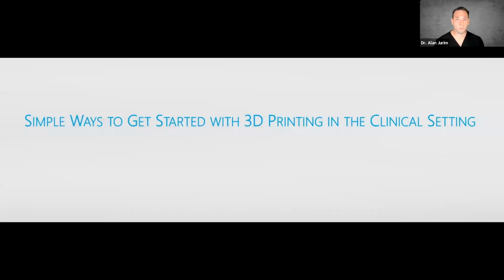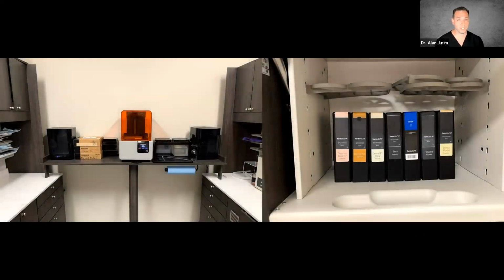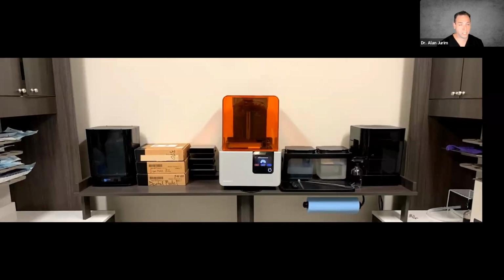So what are some of the simple ways that we can get started with 3D printing in the clinical setting? Well, first thing is to dedicate the proper space for where you're going to be printing. Now, we primarily have two spaces that we use for our printer. We have one space that's in the sterilization room, where you see on the left-hand side we have our printer, our Form Wash, and our Cure and some materials. And then we have our material storage, which is in one of the cabinets on the upper right over here. And what I found to be one of the most important parts to successful printing is really how we have these elements set up.